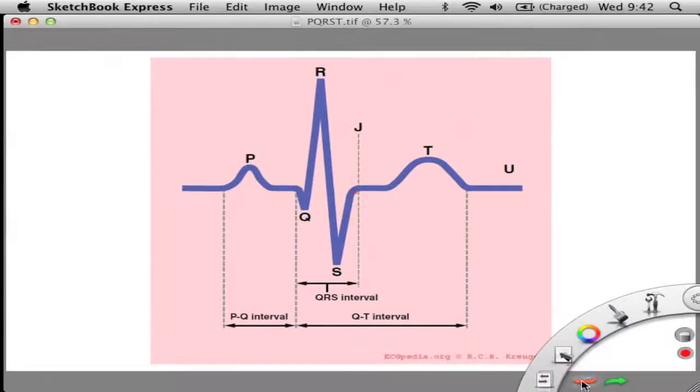Okay. Can your QRS be inverted? Well, we're going to talk about that in a second. We'll talk about it right now. So, your QRS may not always be a QRS. We're going to talk later about why these bumps are positive and negative and that sort of stuff. But you may not always have a true QRS.